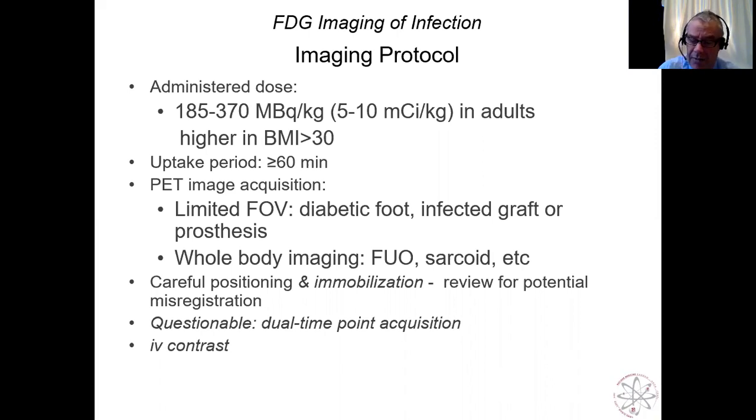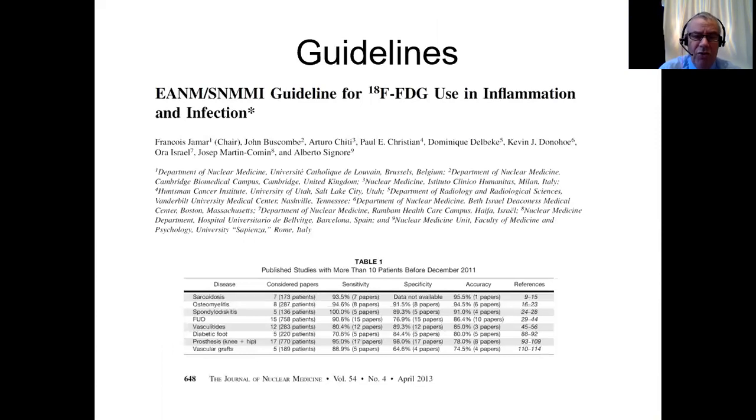And again, some people looked at dual time point acquisition, particularly in Pretoria and also in Taiwan. And the evidence seems to swing one way and then the other. So we're not really sure which is the best way.